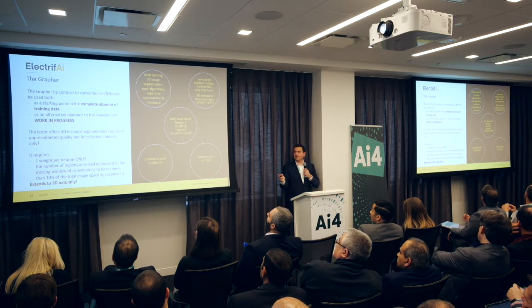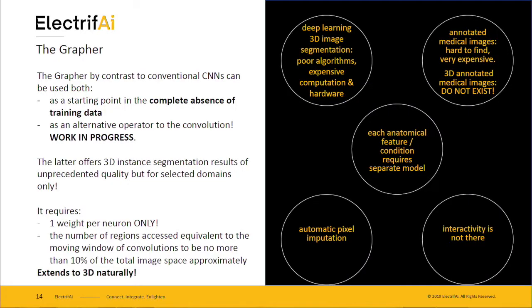So on the right, I have the challenges that we had using convolutional neural network approaches, and pretty much can be summarized into the fact that the 3D segmentation algorithms are not particularly good at performing their tasks, and there are many reasons why this is the case. But let's say the most convincing class of algorithms for 3D medical image segmentation are the ones that approach every slice separately and produce a segmentation there, and then they stack the results. But then you have all kinds of discontinuities that make surfaces appear artificial.